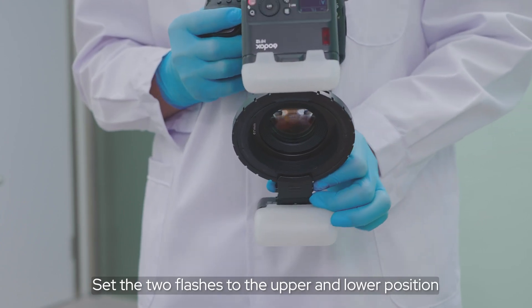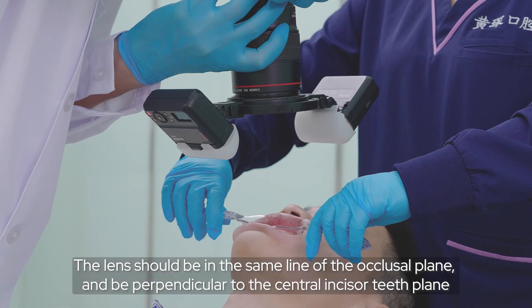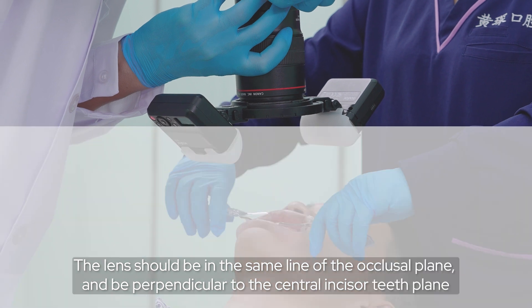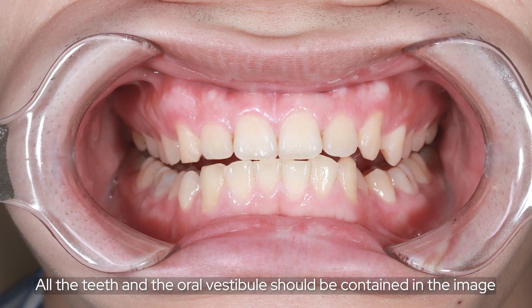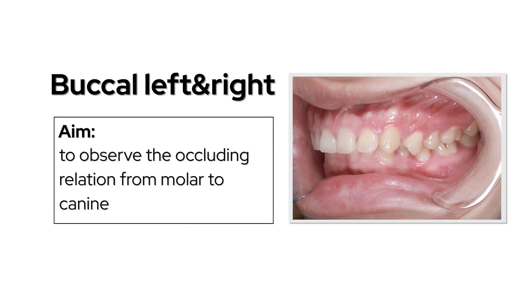Set the two flashes to the upper and lower position. The lens should be in the same line as the occlusal plane and perpendicular to the central incisor plane. All the teeth and the oral vestibule should be contained in the image. Buccal left and right to observe the occluding relation from molar to canine.